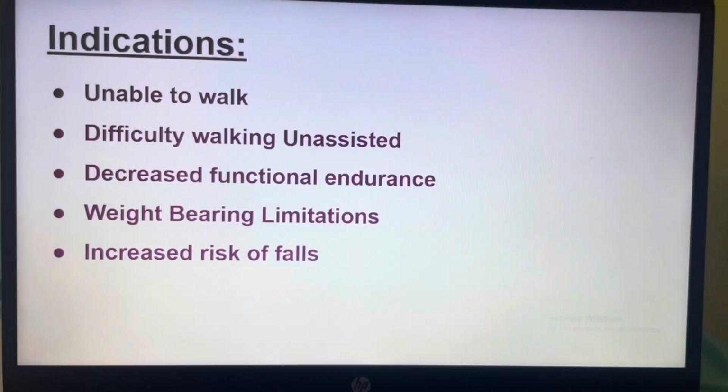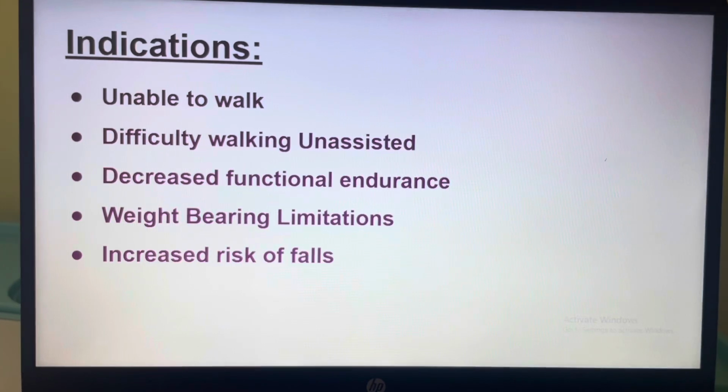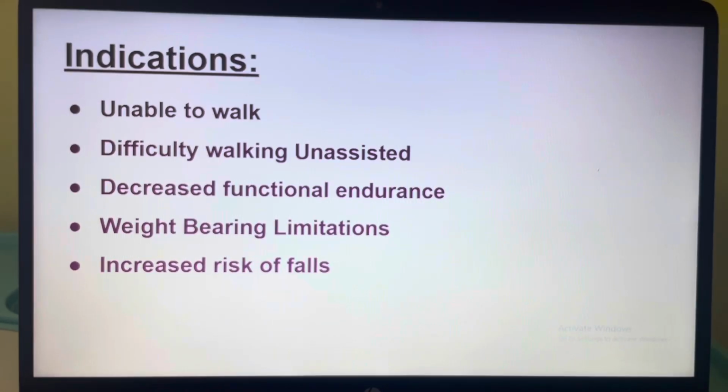Hello everyone. Today we are going to discuss wheelchairs and their parts, different types of wheelchairs, their indications and differences. Wheelchairs are usually indicated for people who cannot walk at all, or who require assistance for walking at all the times.